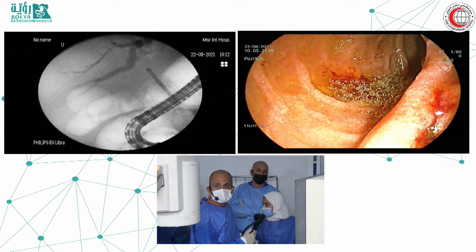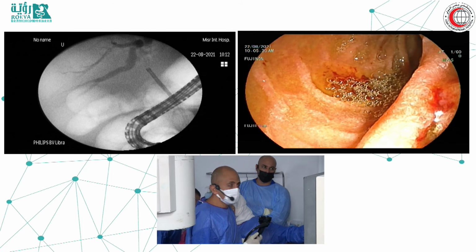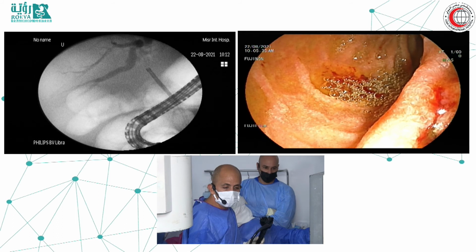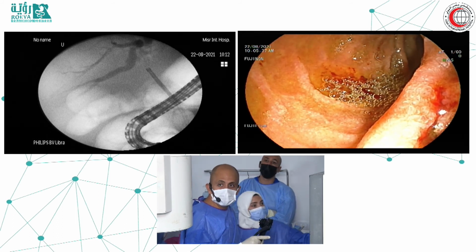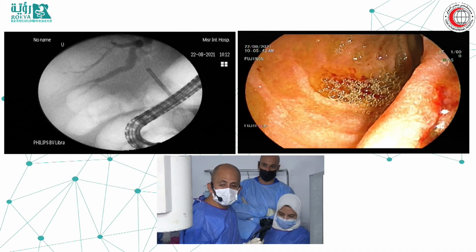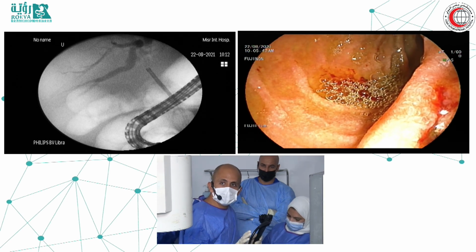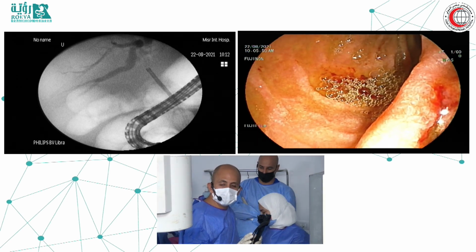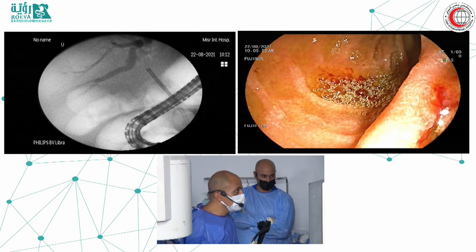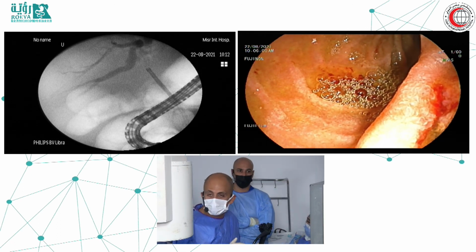but after, for the sake of time, because we need to show you, before we finish the session, the end of the POEM. So my plan today will be to take the spy bite, put a guide wire, do RFA for this lesion, and then put a plastic stent. I will not put a metallic one. I will put a plastic stent and wait for the pathology. If the patient has a malignant tumor, I will change this to a metallic stent in a couple of days. So this will be my plan, and then yes, you can go now because I have pressure from the control room to go to the POEM.